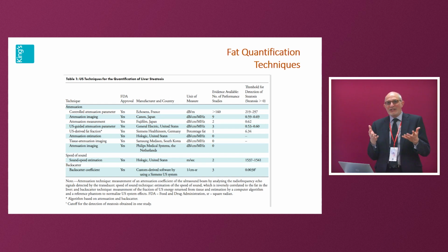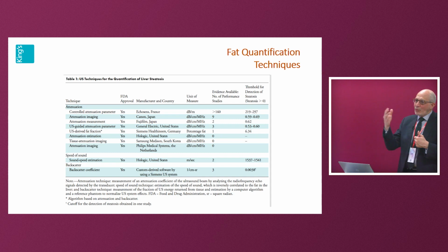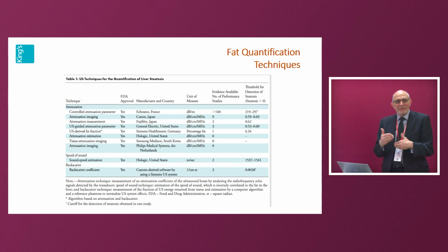And also, the clinicians will understand better what percentage you have. But if you tell them, oh, it's 1.8 decibels per centimeter per megahertz today, you don't understand it. Even though it simplifies it in a manner, you've got something that's transferable and understandable by all who are using it. So I would encourage all the companies to do it. And this is changing, as I say all the time.